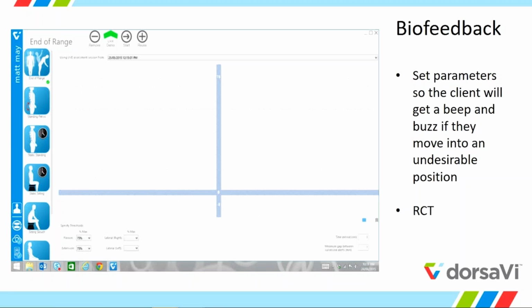So this goes back to that awareness, right? You do the lumbar live assessment and you see their baseline, and then you can do a monitoring session and you can see, wow, look how much you're sitting, or look how much you're sitting and slouched, or look how much you're side bending to the right during your day constantly. This explains why you're having the symptoms you're having. And then you can send them through biofeedback. So they've got those first two things, and then move into the biofeedback, and it just increases awareness all that much more.